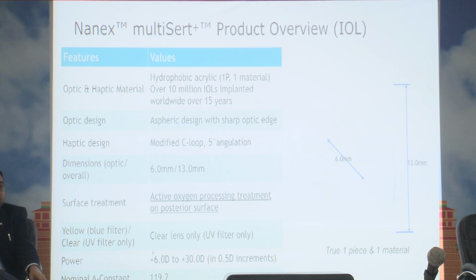So for me as a refractive surgeon, this is very important, where we have lenses with these increments, especially when we are working with higher end optical biometers like the IOLMaster 700 and doing laser assisted cataract surgeries. What is more important is being bang on target with the lenses. So I'll request the industry to supply just the accurate power which is required, more so with toric IOLs, because any 0.5 plus or minus would, as Dr. Anurag was saying, induce aberrations and give you suboptimal results.